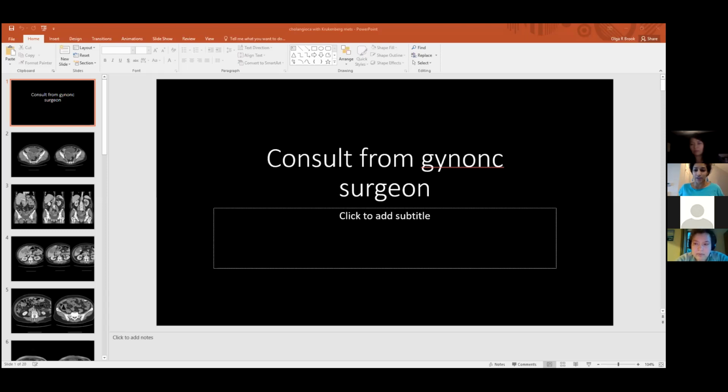I've noticed too that if people have bilateral ovarian masses, I used to just jump to, these must be Mets, these must be Krukenbergs. Then I realized that some people have bilateral ovarian cancer and it probably spreads in both directions along the fallopian tubes. So now, if it's bilateral but you don't see anything in the stomach, liver, pancreas, it could still be primary ovarian cancer. Yeah, that's actually pretty common, bilateral ovarian disease. Sometimes it's microscopic, but in many cases we do see something there. Well, awesome. Thanks for sharing.